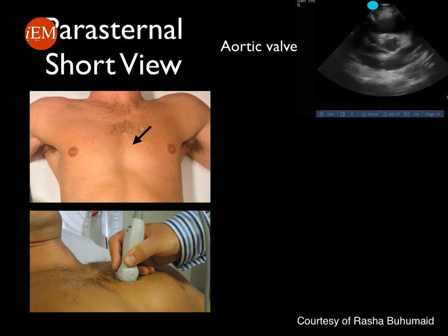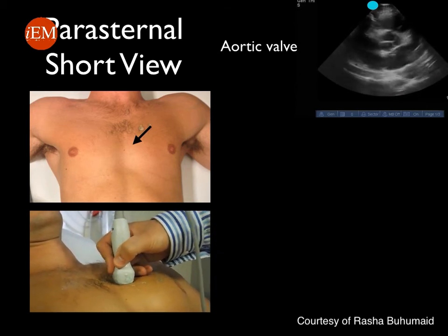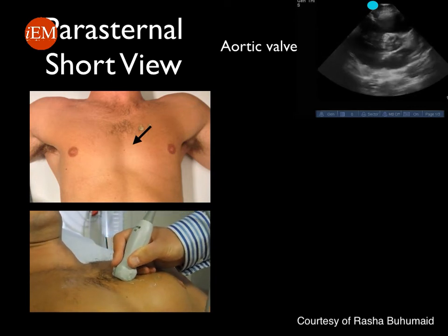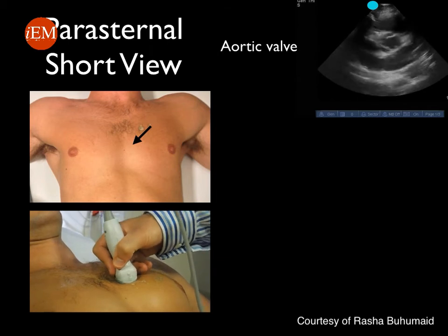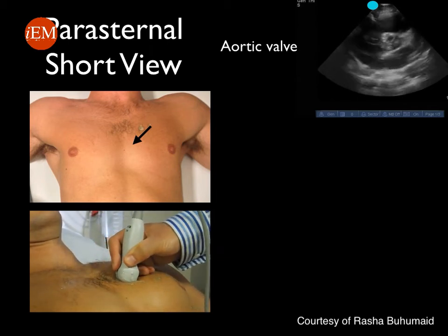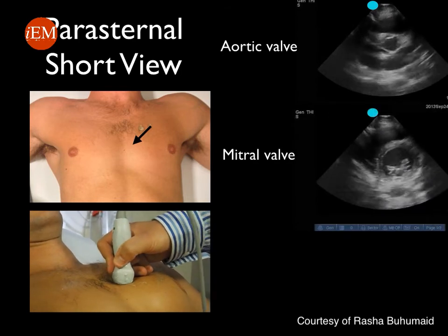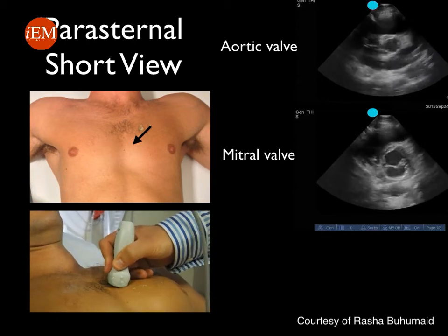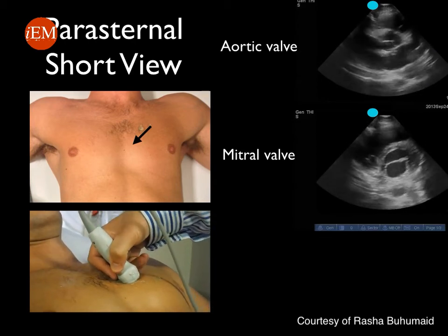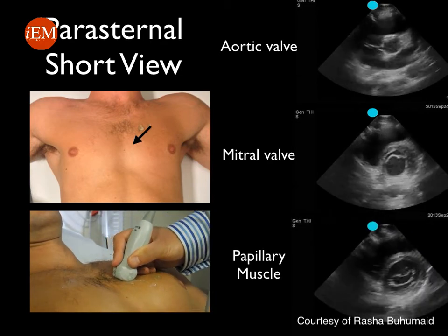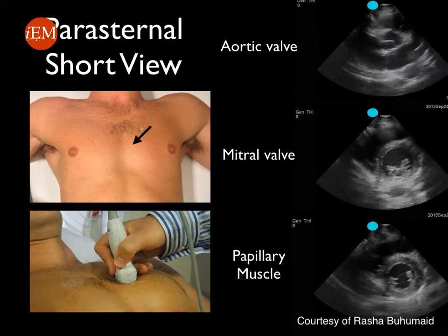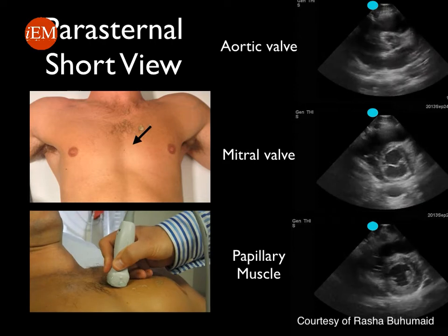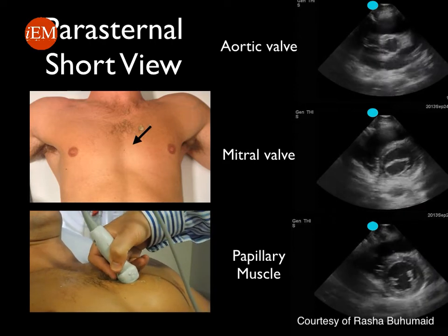If you are angling or tilting the probe towards the shoulder, you will be at the level of the aortic valve and you will be obtaining what is known as the Mercedes-Benz sign, demonstrated in this ultrasound video. If you are more perpendicular to the chest wall, you will obtain the parasternal short view at the level of the papillary muscle, which is the best location to evaluate left ventricular function.